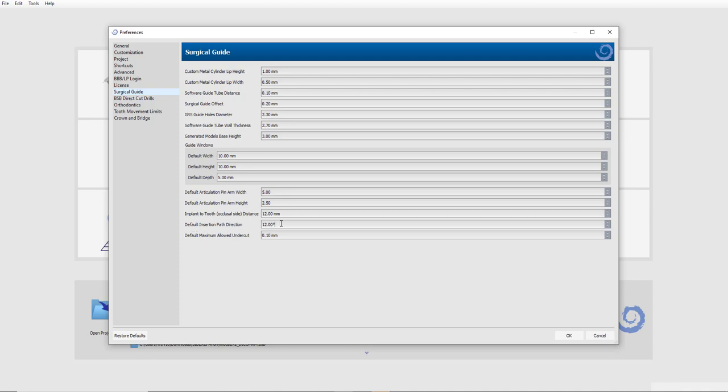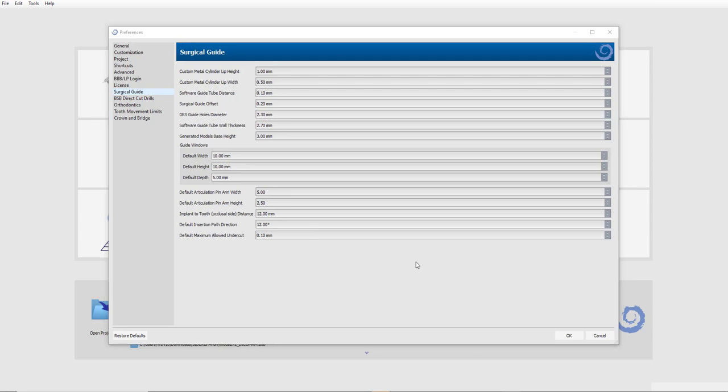So if you want to restore the functionality based on what it was previously, you could go ahead and change this to zero. But we recommend keeping that 12 as your default and using that setting.